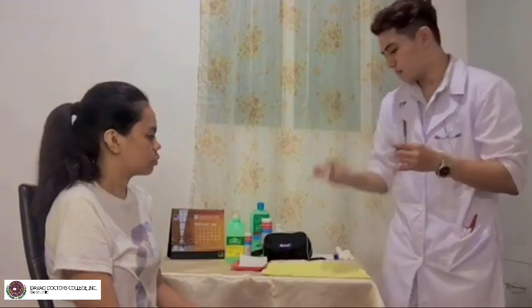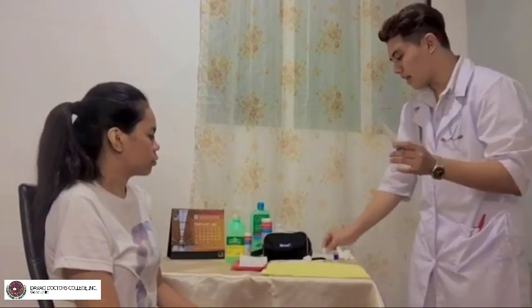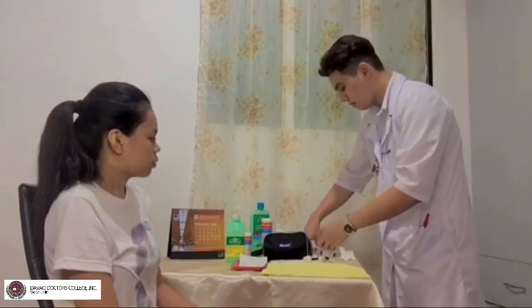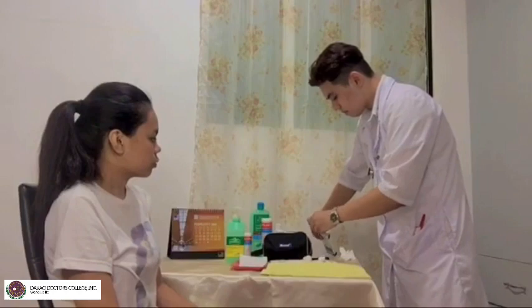So just like this. This is wet and this is dry. Okay. So after that, place this to its right position to the packaging, and then perform hand hygiene.